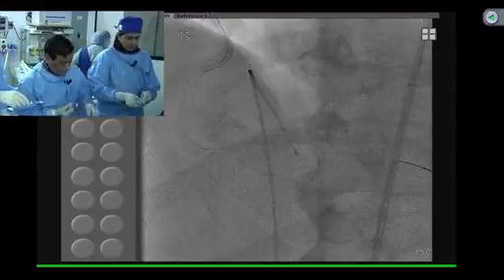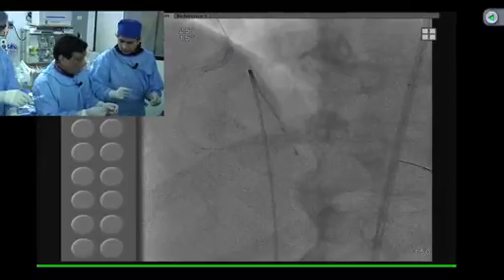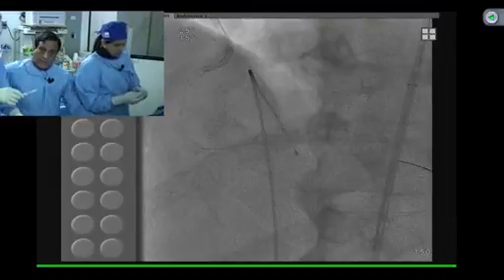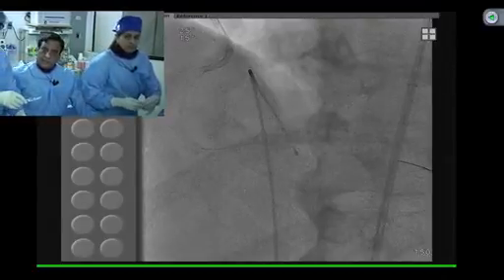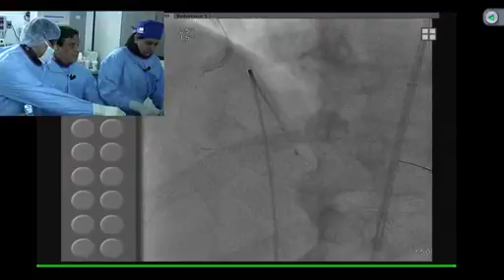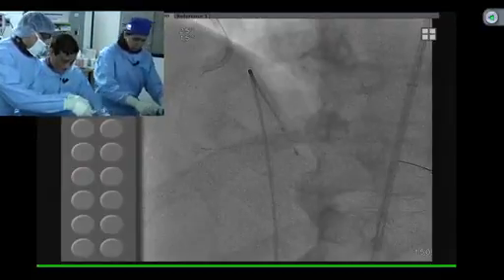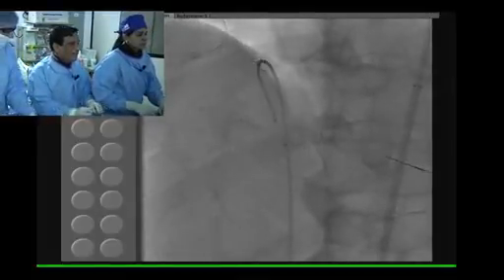The stent did not cross. How often are you doing this? 1 to 2% of the cases, 5% of the cases? No, overall, we use about 600 DES per month. How many return no cross stents? 10, 15, 20? About 15, 20. So the 20 is basically 3%. All 3%, right. And that's very good. You have never needed a calculator in your life, I can see. Yeah, that makes sense, I think.